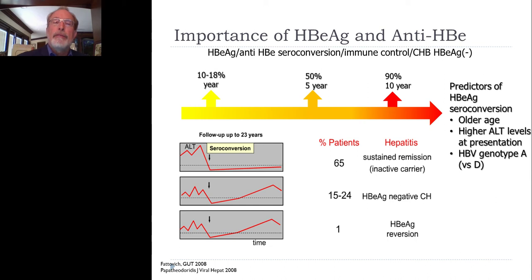It can detect as many of these S antigen variants as possible, because we want to know accurately our patient's hepatitis B status. We need to know that in terms of vaccination, maybe even help us in terms of developing new vaccines later in the future in case we have these escape mutations and they become clinically important.